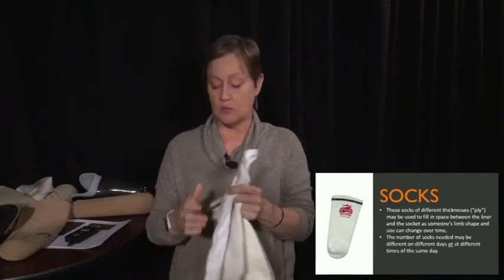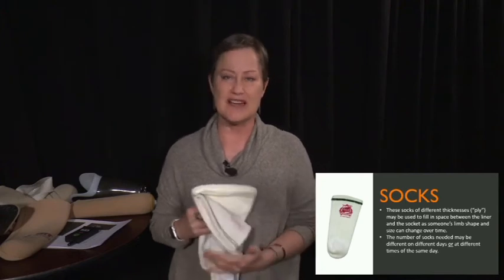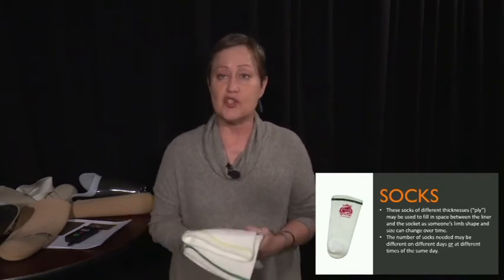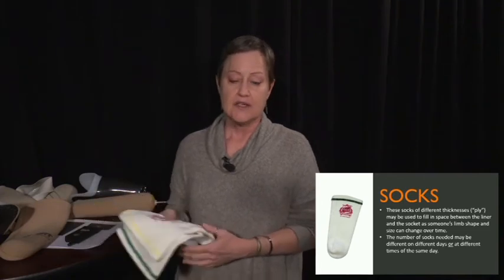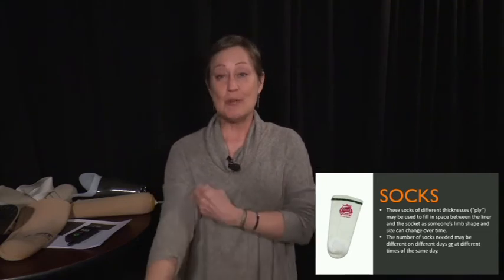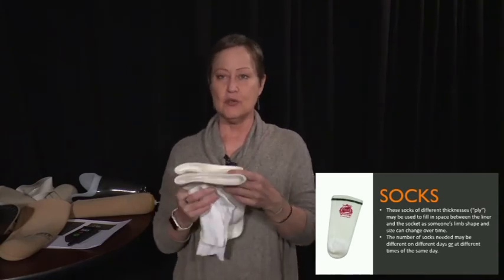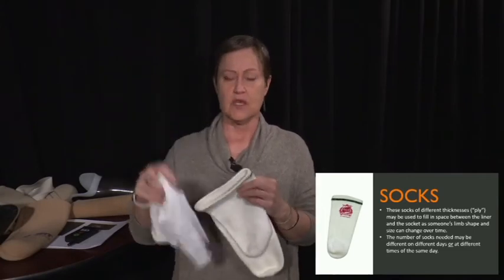When I worked regularly in my hospital outpatient clinic, I always had a supply of 2-ply socks. I never knew when somebody was going to forget their socks and need to add one during the course of a therapy treatment, which honestly happens quite a lot. So let's not forget that this is where it's at. Your patient should have gotten these socks when they got their leg delivered. So our company gives two or three, I think, of the 3s and 5s and 6 of the singles.